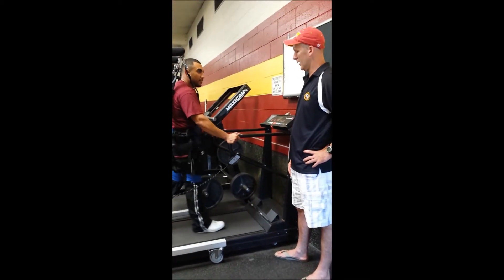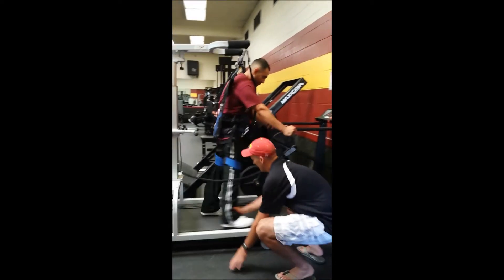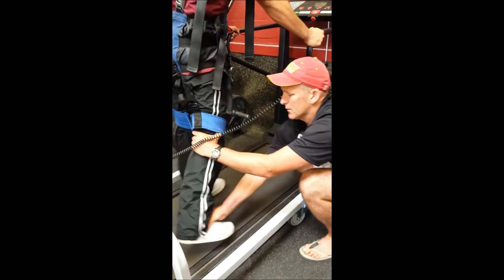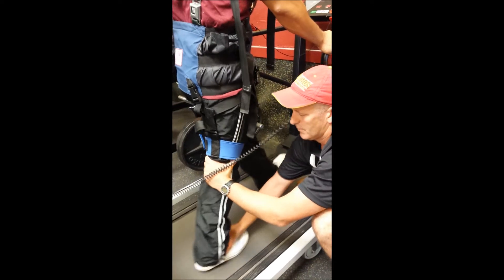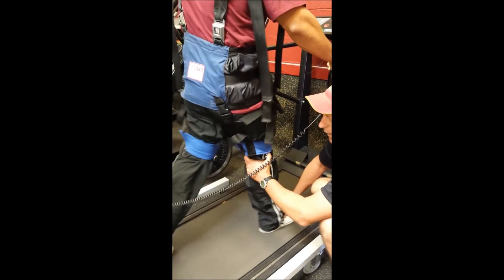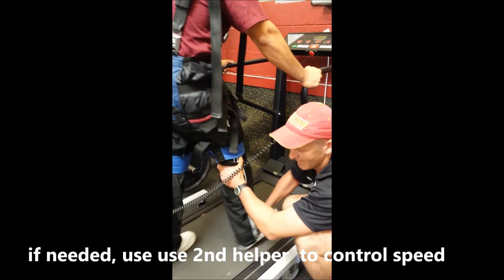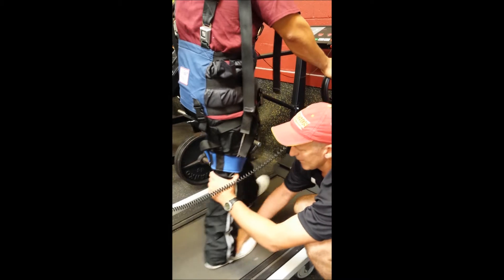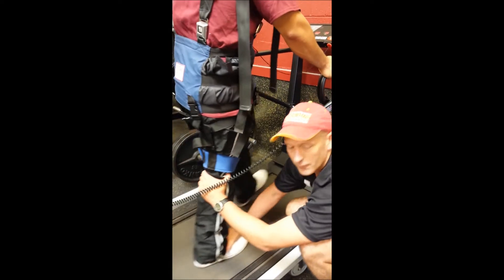Tim's moving along really well. Tim, could you demonstrate a foot drop on your right side so that your toe drags as you bring it forward? Good. Now I'm going to come in and work with Tim on bringing that forward and cue him. For safety, if Tim were as impaired as he was just demonstrating, I would have a second person at the speed controls and emergency button. Lightgate makes a stool I can sit on so I'm not crunched over in this position.